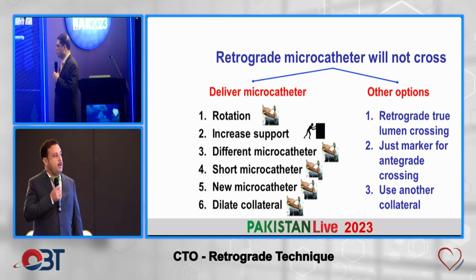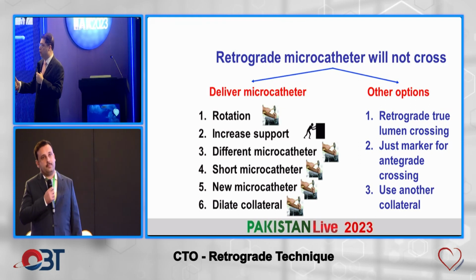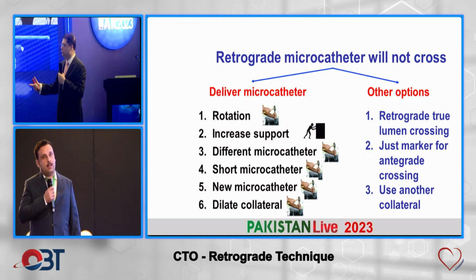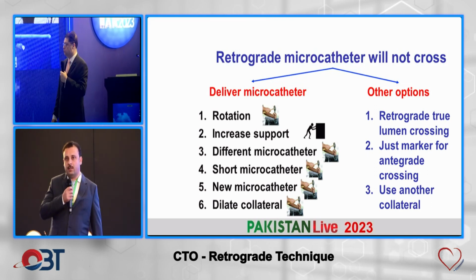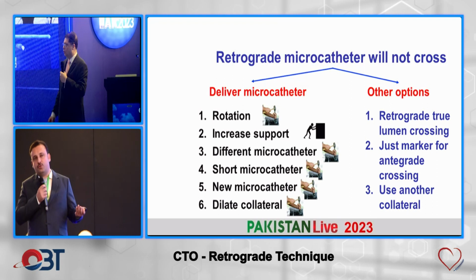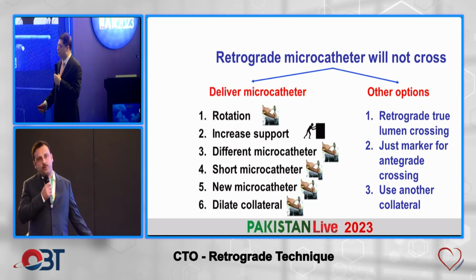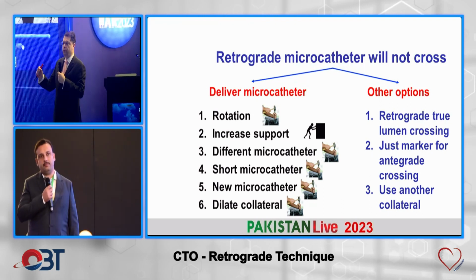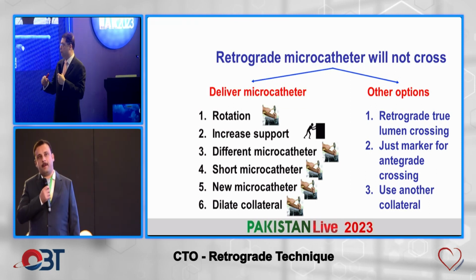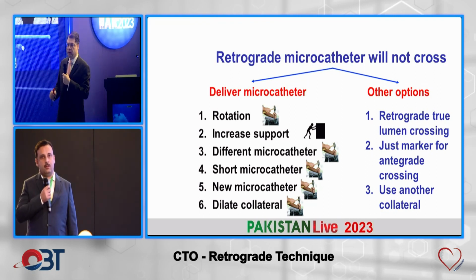And so which would be your microcatheter of choice in a septal collateral and in an epicardial collateral? I think the best catheter these days is the Corsair Pro XS. But now we have two choices. Either Corsair in both the septal and epicardial? For epicardial, low profile catheters like the Caravel or FineCross are so good. Caravel is probably the lowest profile catheter, which is more suited for the epicardials. And a catheter with rotation like a Corsair Pro XS is probably better in a septal collateral.